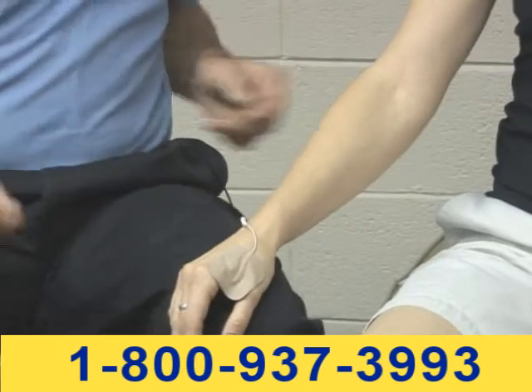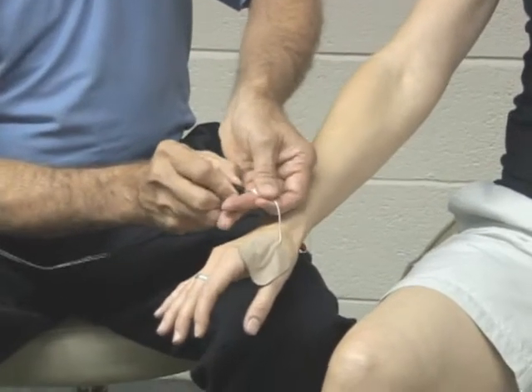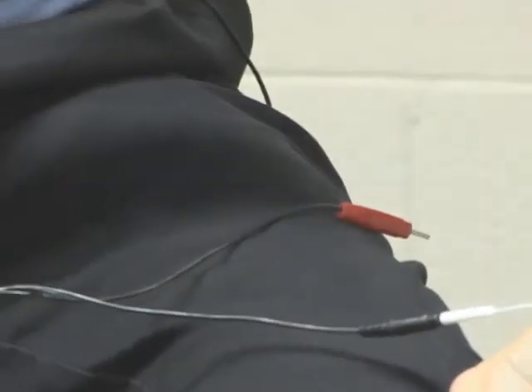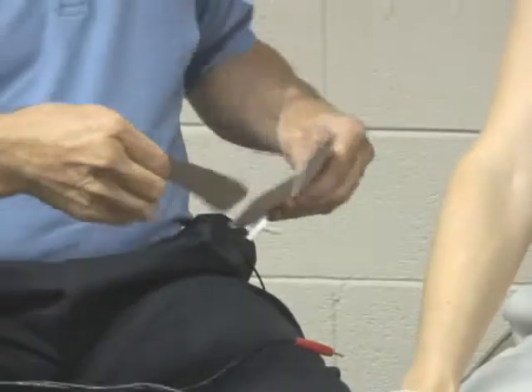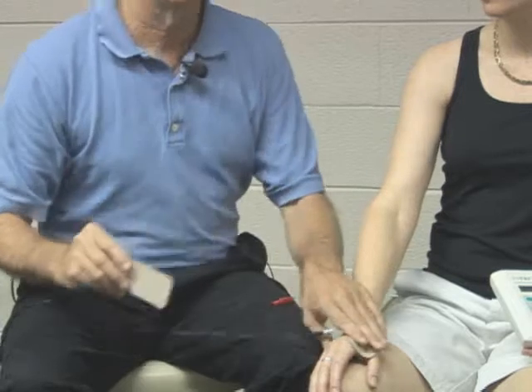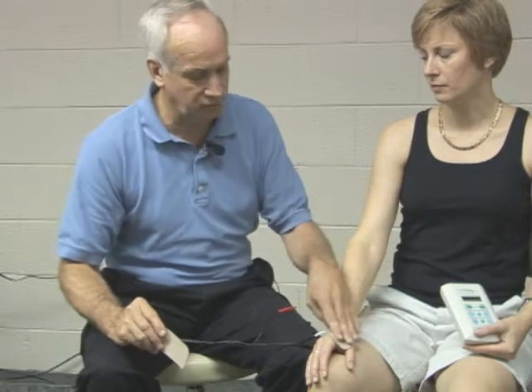The other thing I would do after placing that is take one of the cables and put it in here. Then I would take another electrode. One of the reasons I'm going to use a larger electrode now is because we are always going to start off on interferential mode — specifically low-rate interferential mode. You can call us and we can show you how to set up the InfraX Plus to do this.